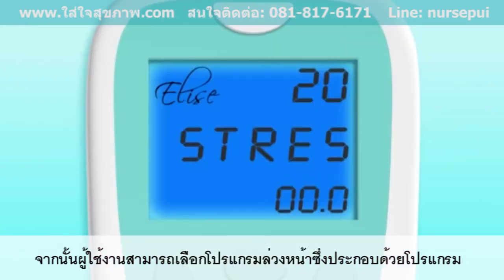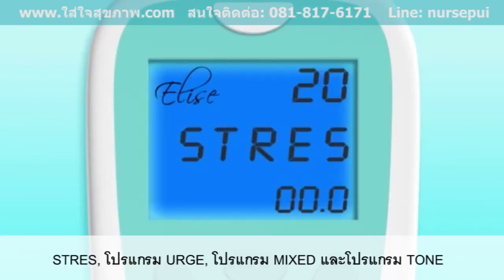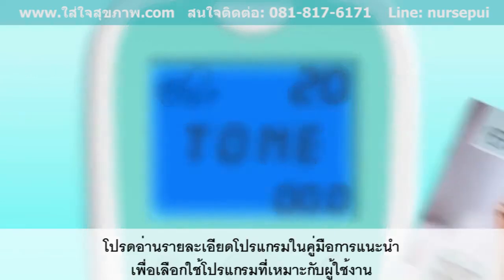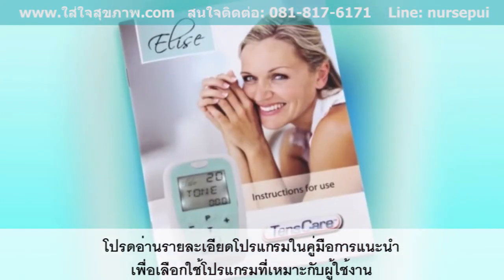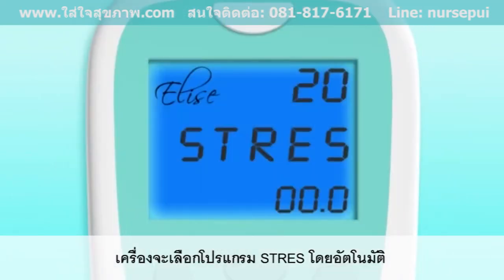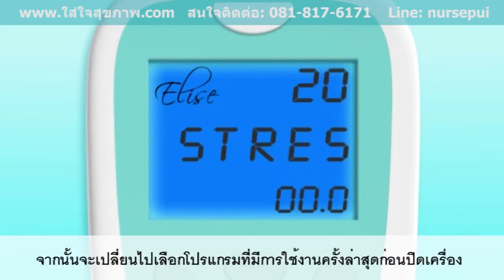Press and hold the power button for 3 seconds to switch the controller on. You can now select from the preset programs: Stress, Urge, Mixed or Tone. Details in the instruction manual will help you identify the best program to suit you. The unit will automatically select the Stress program the first time it's switched on. Thereafter, it will automatically select whichever program you were using the last time it was switched off.